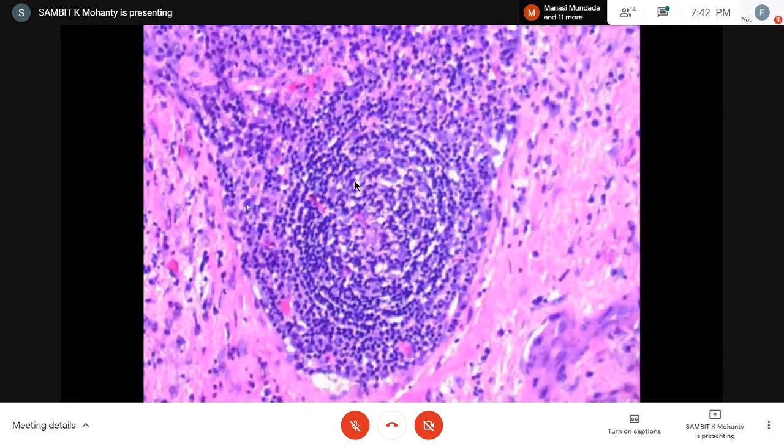So in the periphery we have these bigger cells and the center. But look at this center, which is pale, and there are some paler cells which are kind of getting into this area, and this is very tightly packed. I was not very comfortable naming it as a reactive or a residual follicle, so I don't know, somehow my brain was stuck.